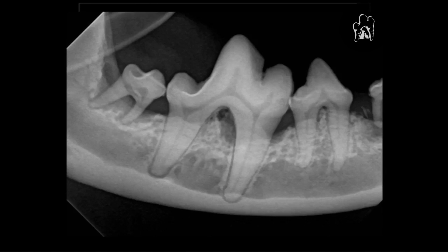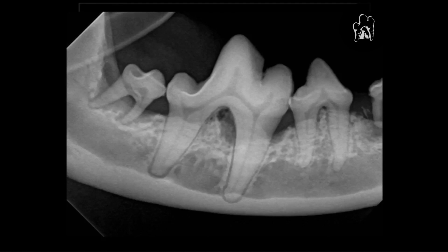It's important to remember that as long as that granulation tissue stays in there, that's infected tissue that is full of gram-negative anaerobes that is releasing inflammatory mediators that are destroying the bone. So if that granulation tissue remains, so does the disease process. At the very least, we need to get that out of there, and we do that with a periodontal curette using our hand instrumentation.